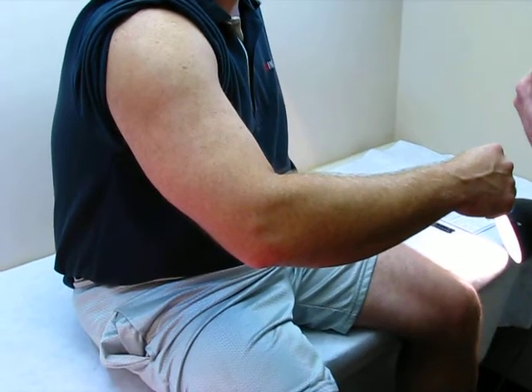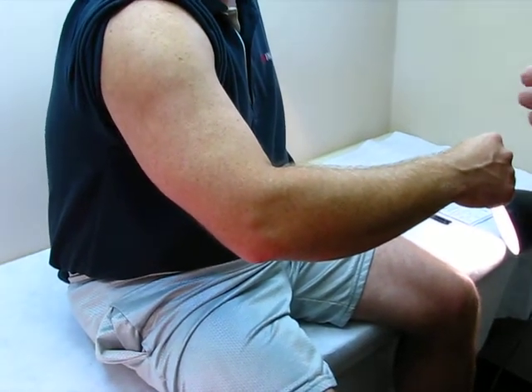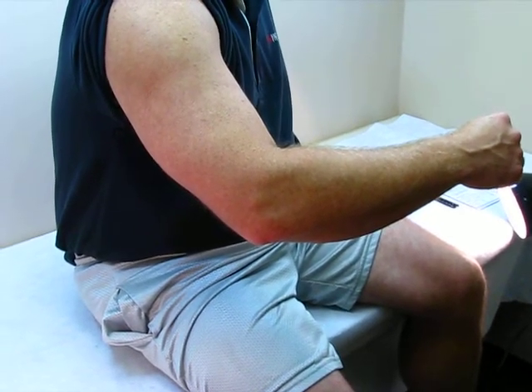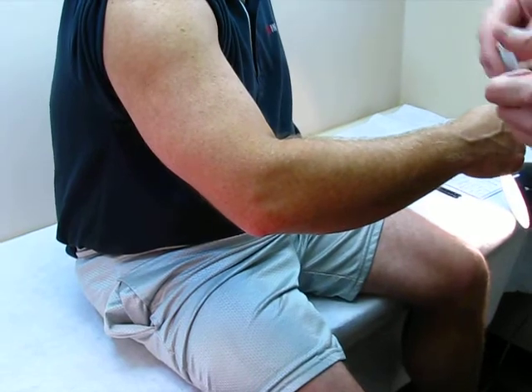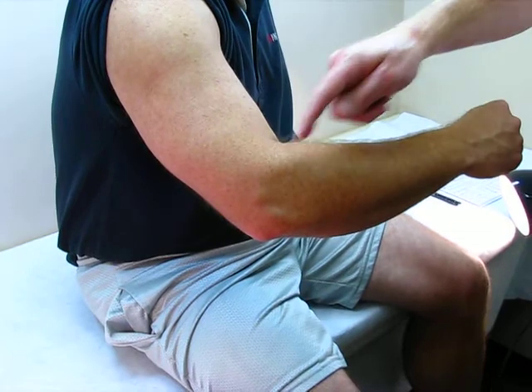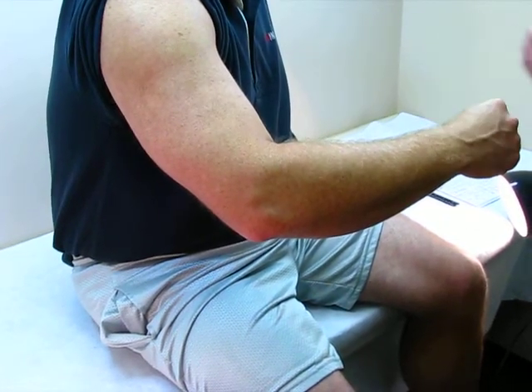Today we're going to be measuring for an Ortho Innovations Custom Elbow Mackie Splint. Since this splint is a custom measurement, we will be doing six measurements. We'll do a circumference and a medial lateral proximally, at the elbow joint, and distally at the wrist.